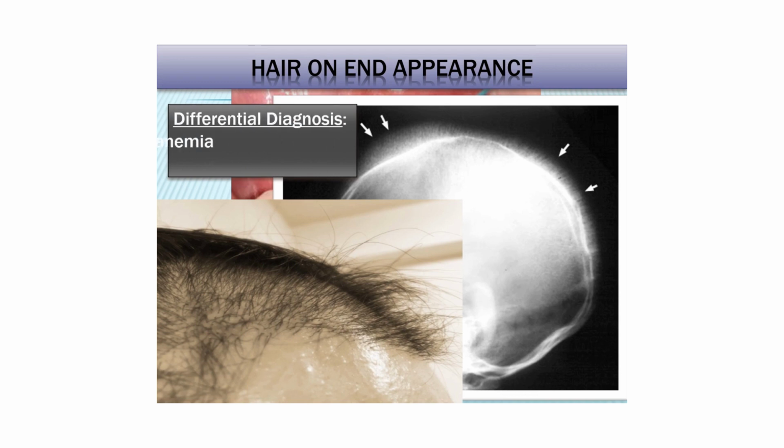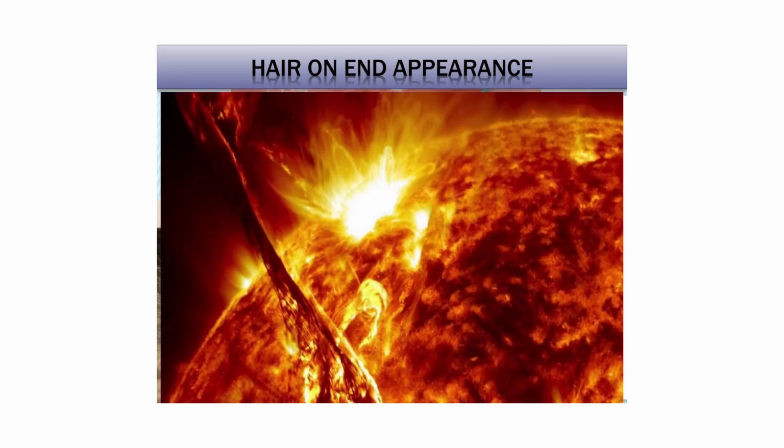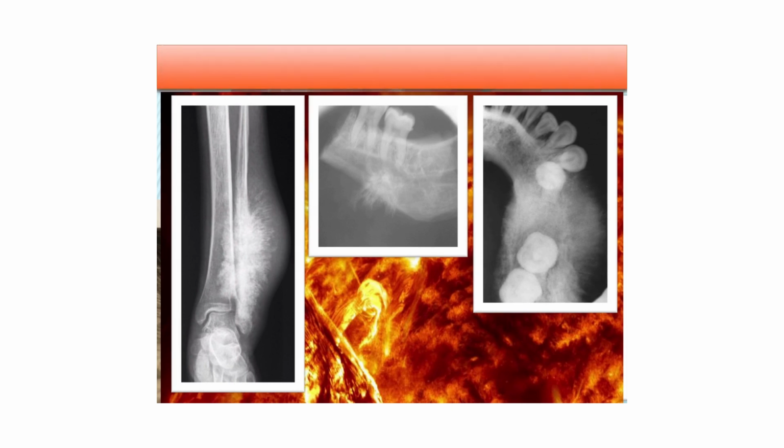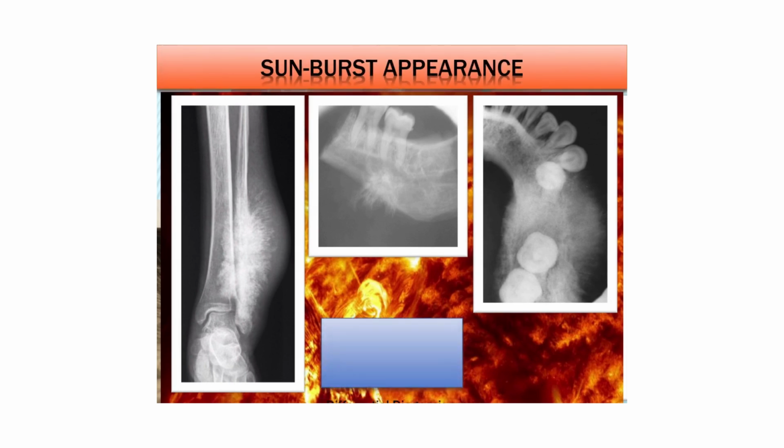When rate of growth of lesion is faster and the periosteum does not have enough time to lay new layer of bone, in such cases sunburst appearance can be seen wherein the periosteum is displaced, partially destroyed and or reorganized. This is seen in osteosarcoma, osteoblastoma and hemangioma.